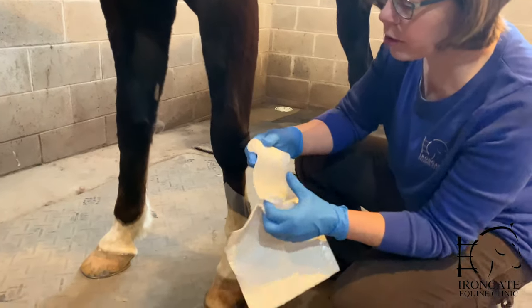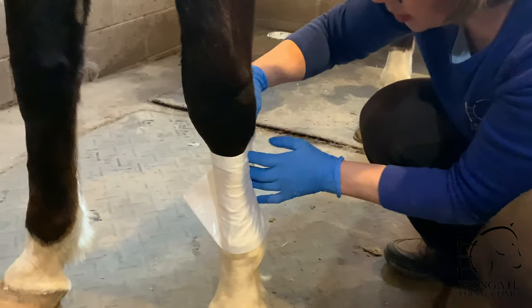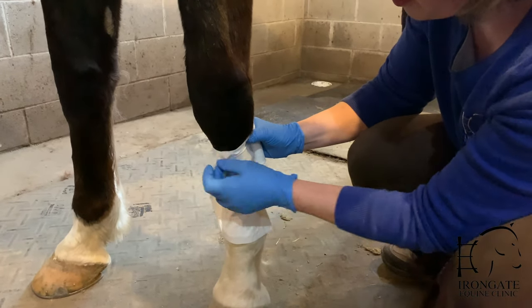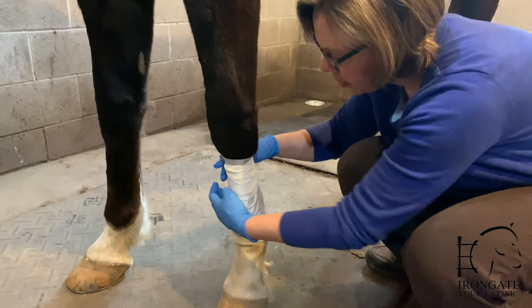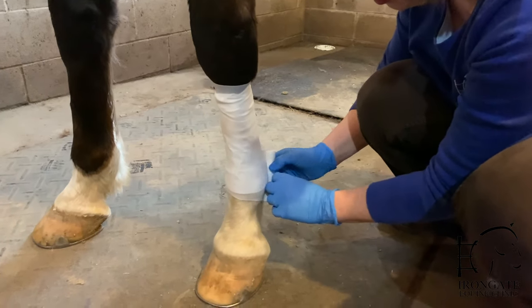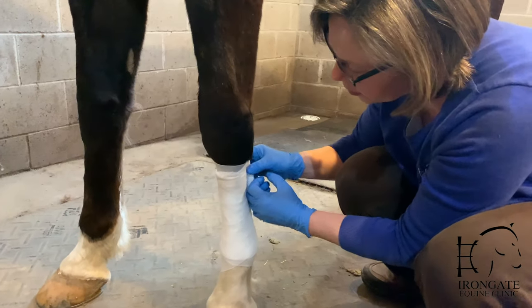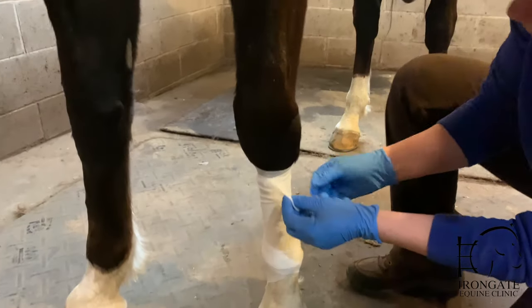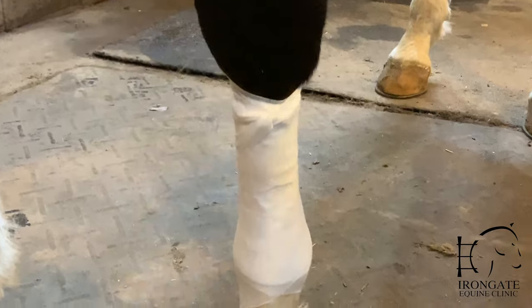Then we'll take some cotton form or a stretchy gauze to hold this in place. Just lay that gently across the wound and start to wrap either at the top or the bottom. You don't want to pull this too tight — just tight enough to keep this in place, so really just roll it onto the leg. Try to have as few wrinkles in the gauze as possible, because that will make the bandage more comfortable. When you get to the end, you can unroll the last bit and tuck it under one of the other rolls. So that's your first layer.